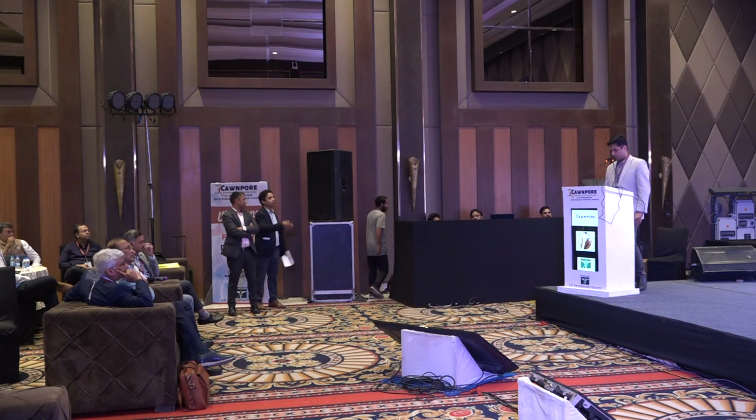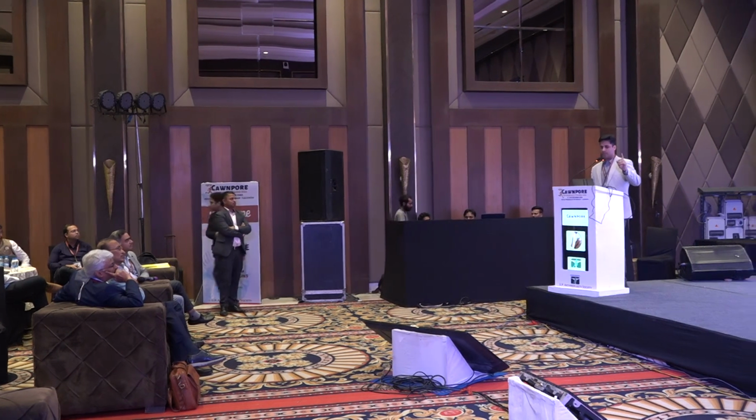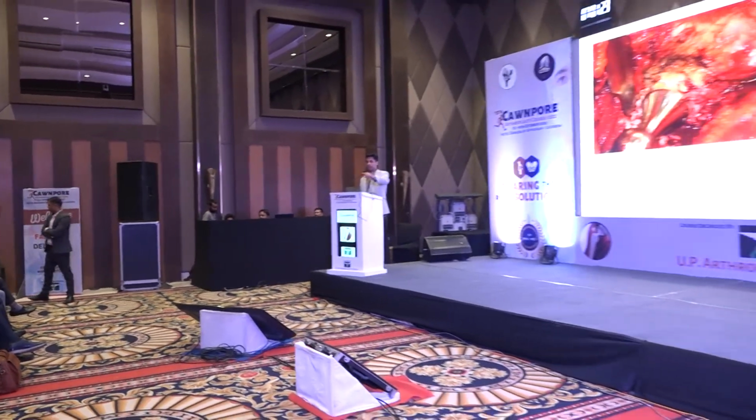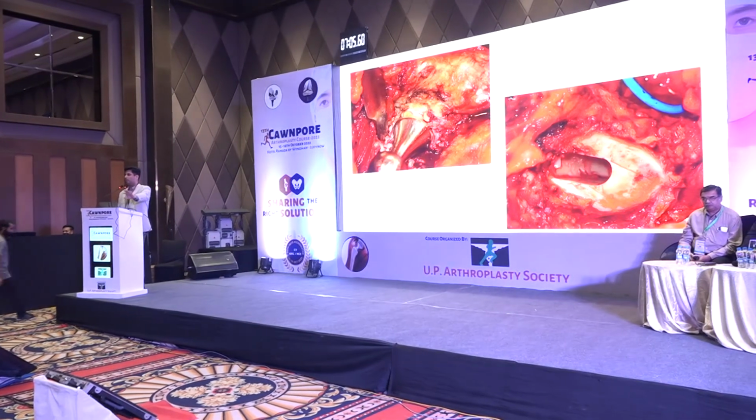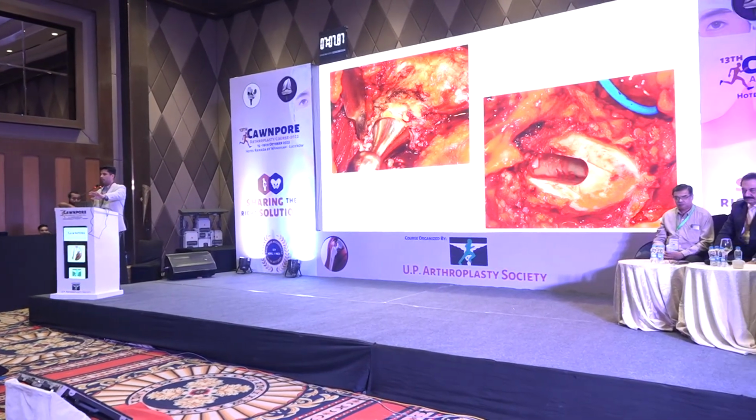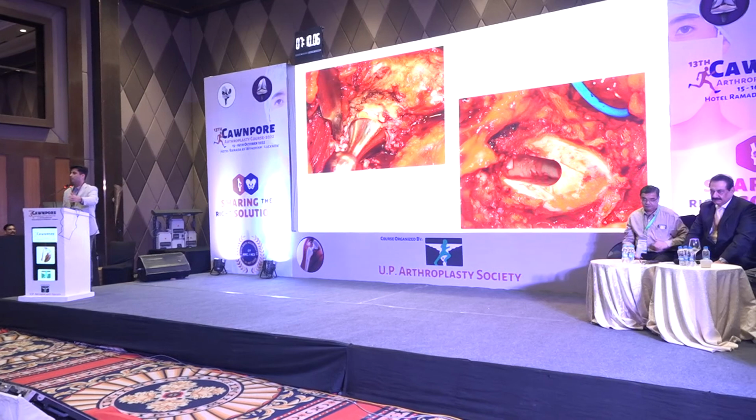Yeah. All right, so I was talking about the extraction of these cemented prostheses. All you got to do is remove that little granulation tissue around the implant, and all you got to do is tap it out, and you'll get a nice looking hole like that. The problem is really removing the cement.